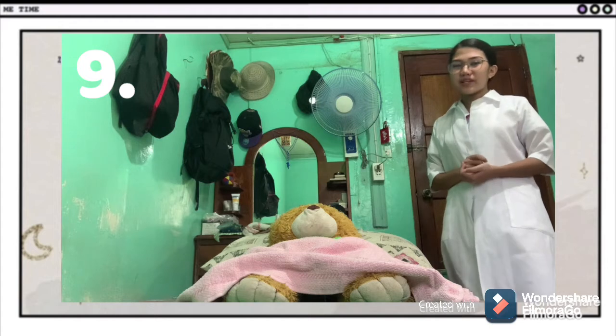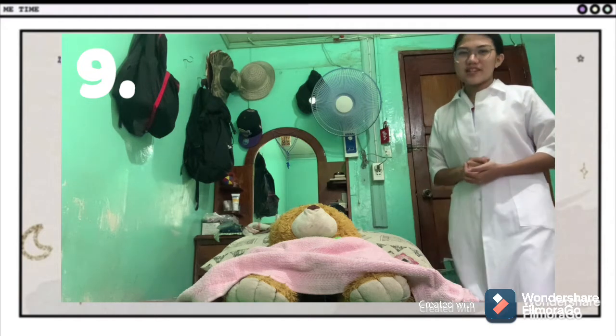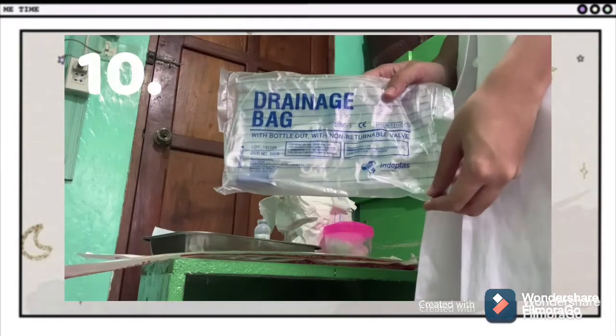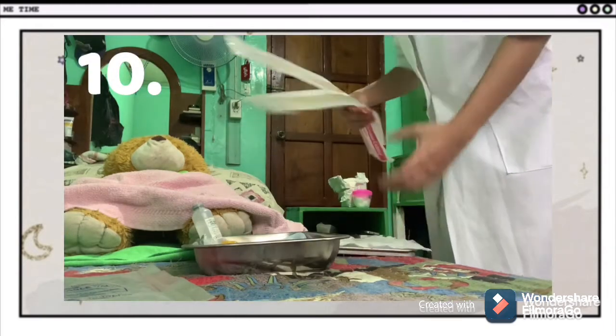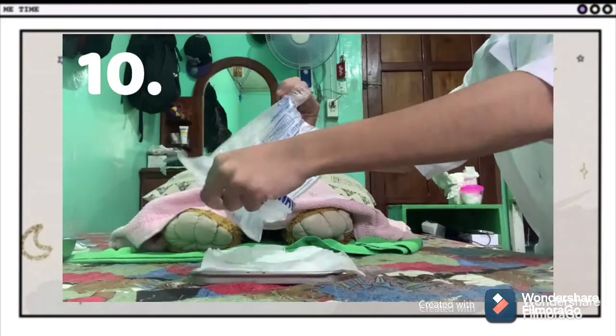Prepare the urine receptacle and tubing if an indwelling catheter is to be inserted. Tubing facilitates connecting the catheter to the drainage system. Open the pack and place it near the perineal area. Observe aseptic technique. Placement of the equipment near the worksite increases efficiency. Sterile technique protects the client and prevents the spread of microorganisms.